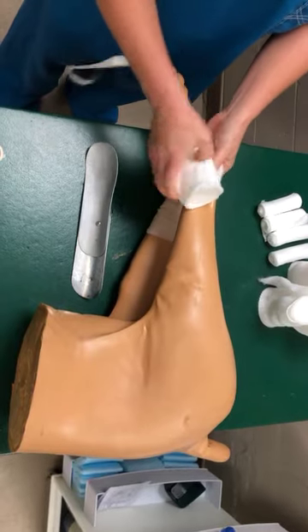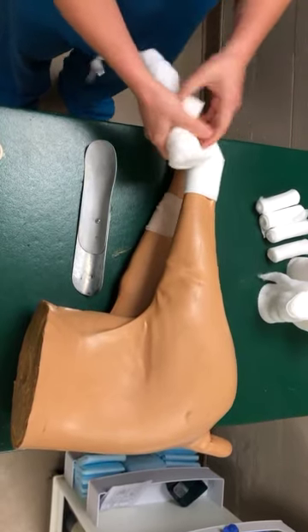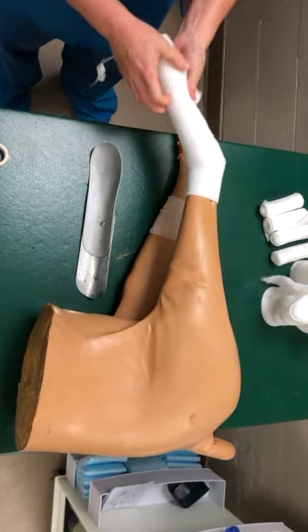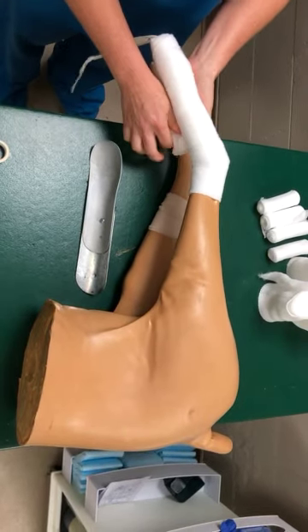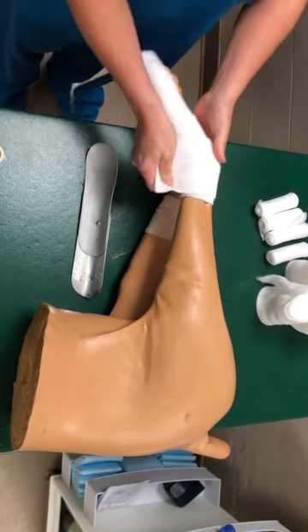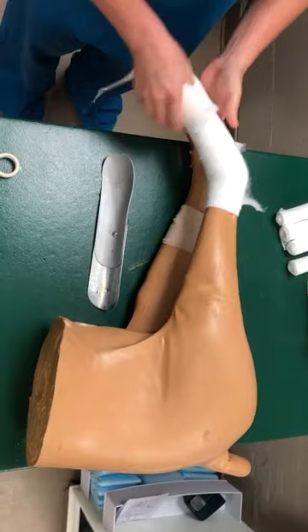We have a metatarsal fracture, so we have to stabilize the joint above and below — I need to go above the tarsus. We'll get a nice layer there and come back down. We want to make our padding in the same shape as our splint. The splint is straight but our patient is not, so we will use this padding to build up the areas that need more. We want to make sure this is comfortable for our patient, so we'll get a little bit of extra padding.